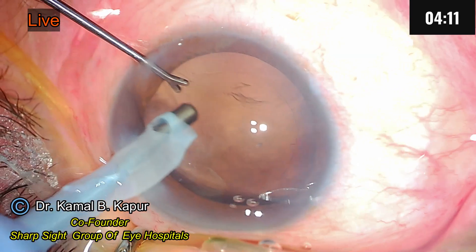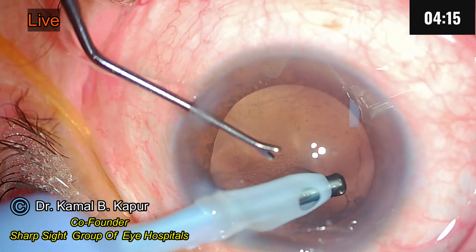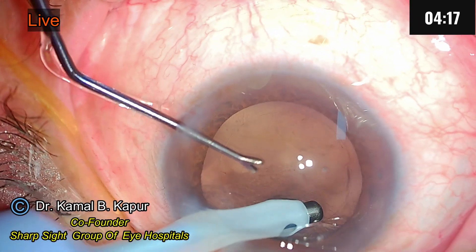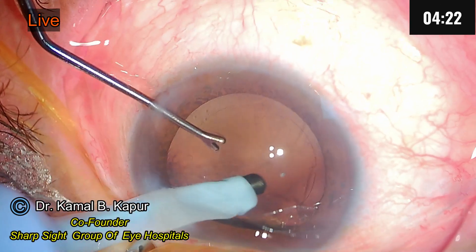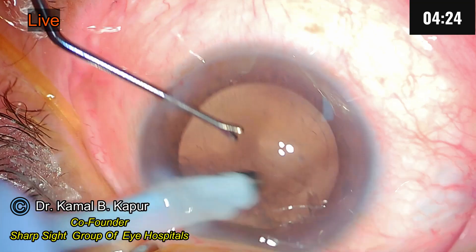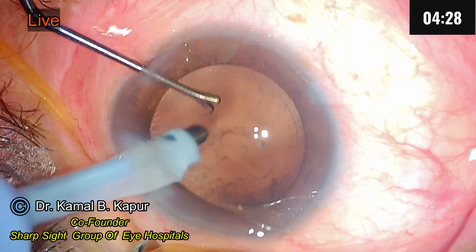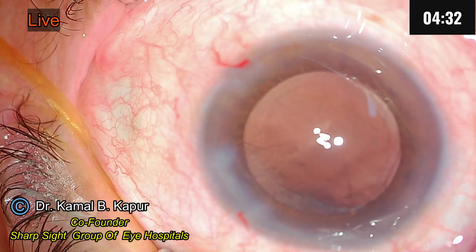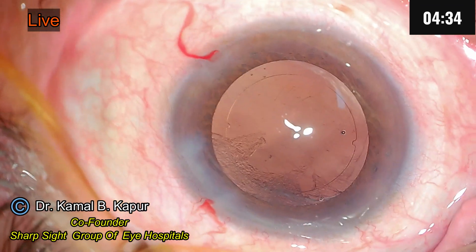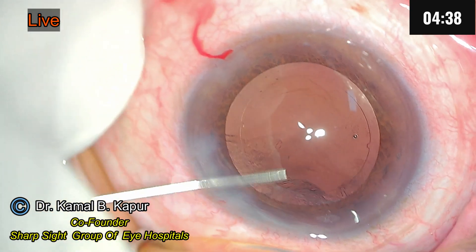So the intent is to rotate the nucleus many times before you start. Now we will try to polish the plaque. Whatever remnant of plaque on the posterior capsule, we will try and polish it by doing the hydro-jet technique. You can watch my other videos on this particular procedure and step.